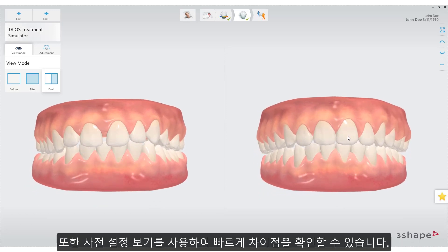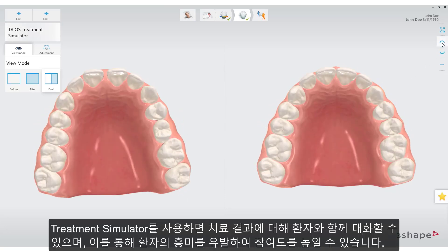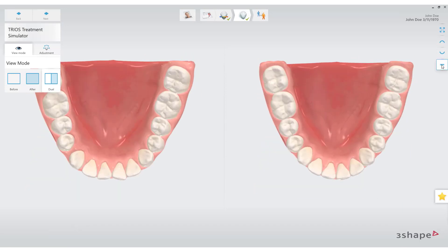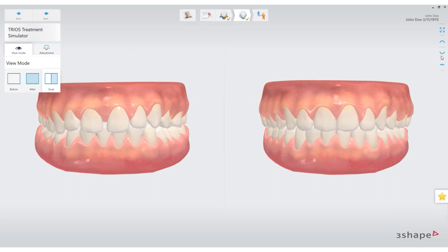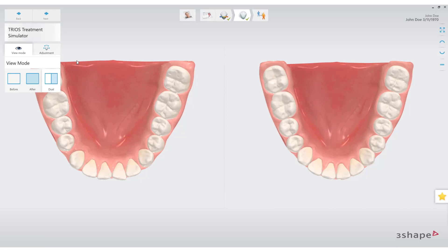Quickly show the differences using the preset view. Treatment Simulator enables dialogue with the patient about what can be accomplished with their treatment, helping and getting them more excited about the treatment. If needed, the simulation can be adjusted, helping the patient understand the decision process in finding the desired result.